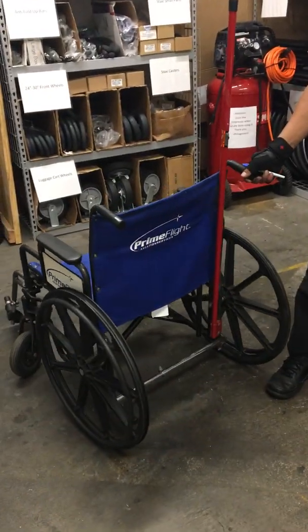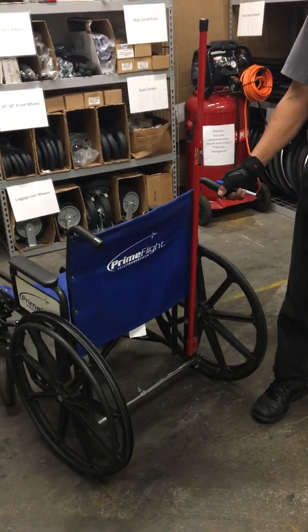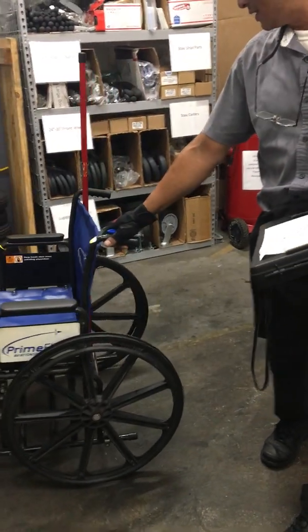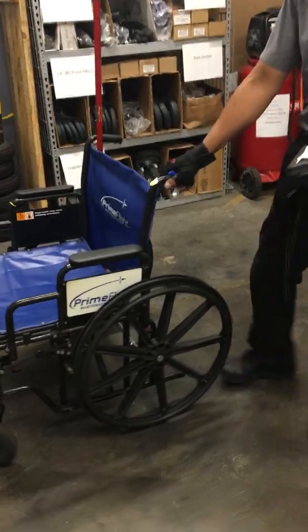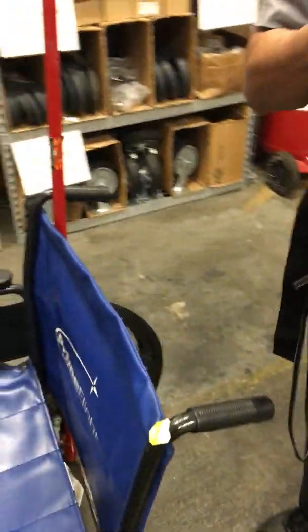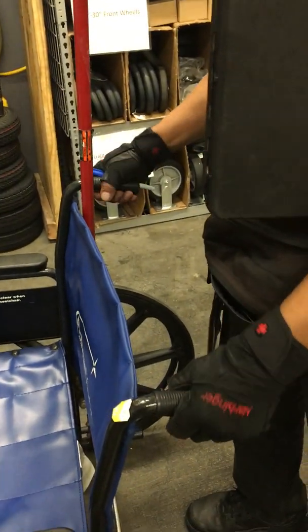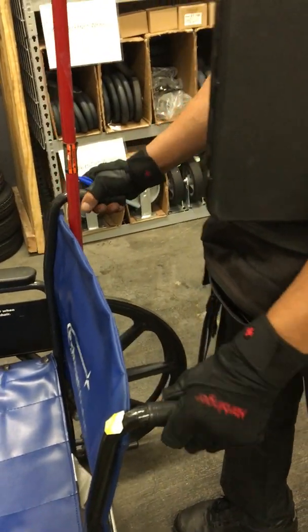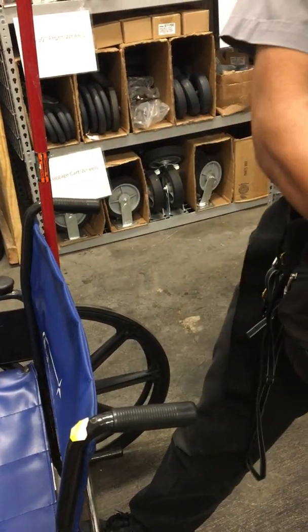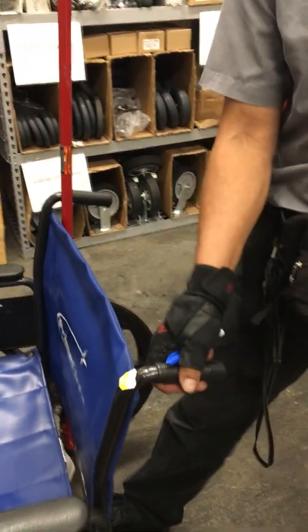It's a Prime Flight 24-inch folding chair. The first thing that I would inspect in this wheelchair is the handles. There are times these handles would be easily movable and it would pull off. So out of safety, I would change these and it would take normally about 10 to 15 minutes.